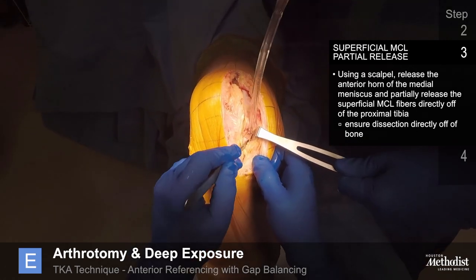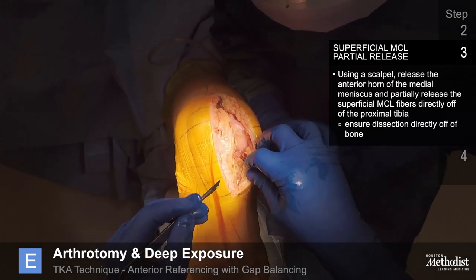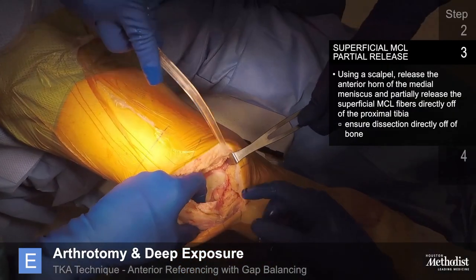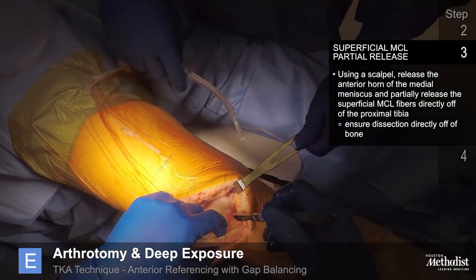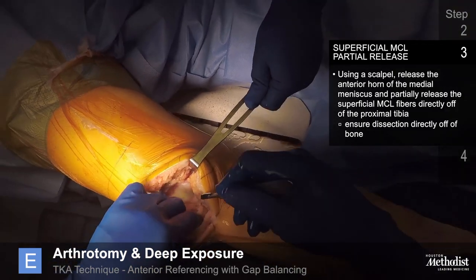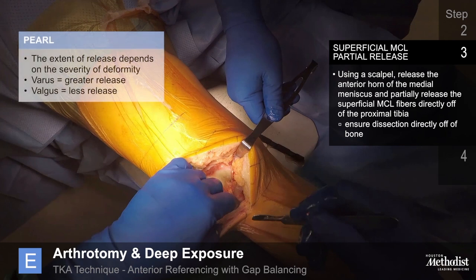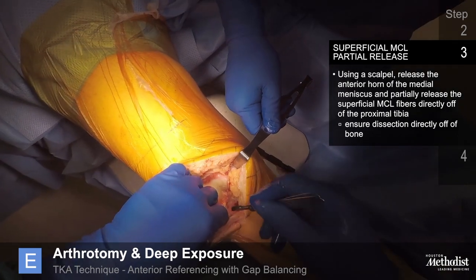Using a scalpel, release the anterior horn of the medial meniscus and partially release the superficial MCL fibers directly off of the proximal tibia. Once this is done, extend the knee. A small right-angle retractor can be placed to retract the entire medial meniscus and MCL sleeve, ensuring dissection is directly off of the tibial bone. The extent of the MCL release depends on the deformity; a general rule is to carry out this dissection to the mid-coronal plane of the tibia. More severe degrees of varus malalignment will require more release of the MCL sleeve. In a valgus knee, the MCL dissection is kept to a minimum. Release the fat pad from the proximal tibia.